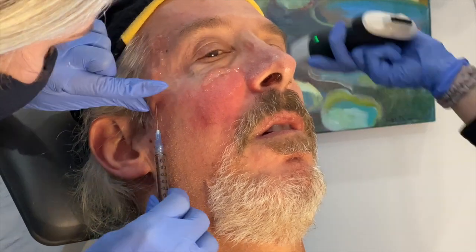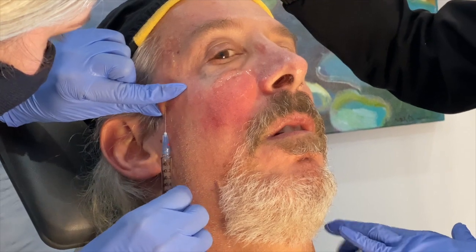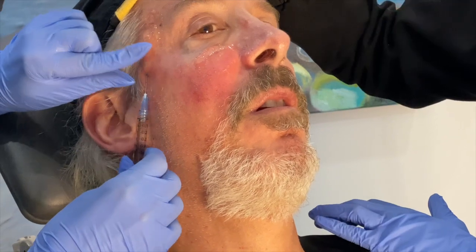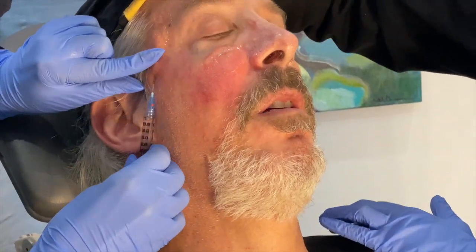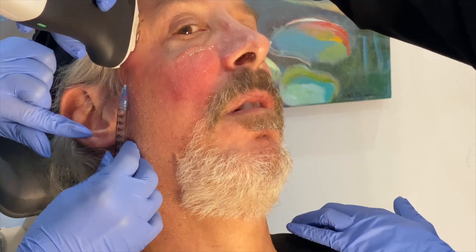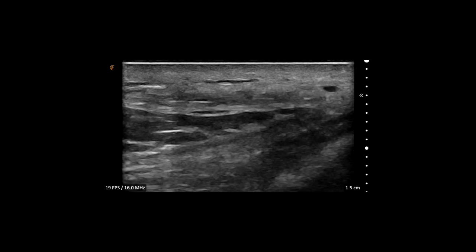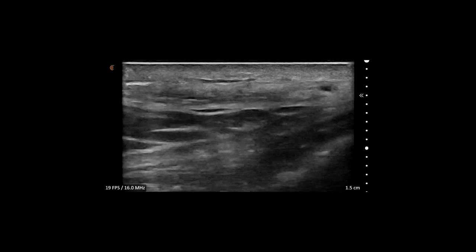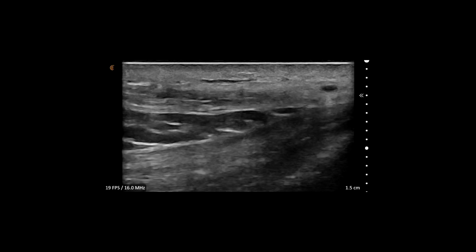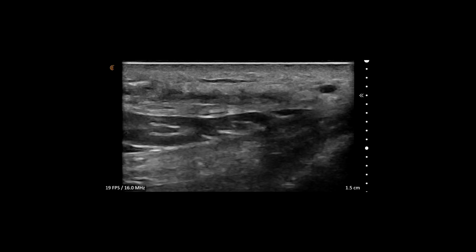I am training my PA right here on the proper injection for the temple. I like to inject it in the interfacial plane, which is between the superficial temporal fascia, which contains the superficial temporal artery, and the superficial layer of the deep temporal fascia. I'm using the Clarius ultrasound to confirm the placement of the cannula. On the upper right you see the superficial temporal artery pulsing. On the left side you see the cannula laying on the deep temporal fascia and it is injecting filler in this interfacial plane.